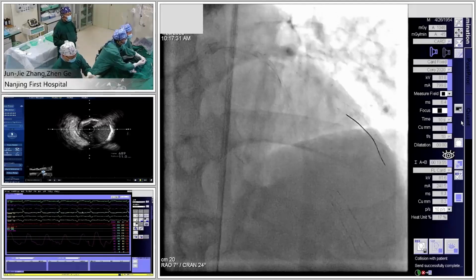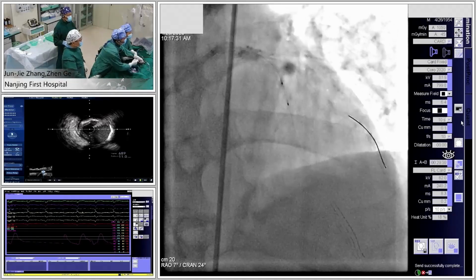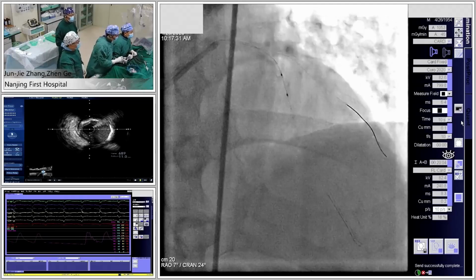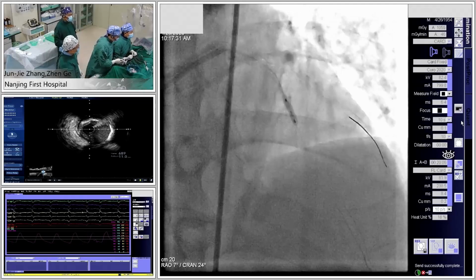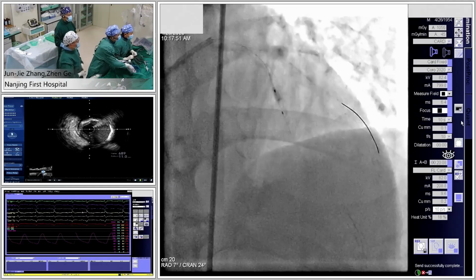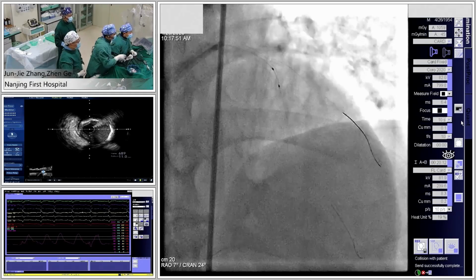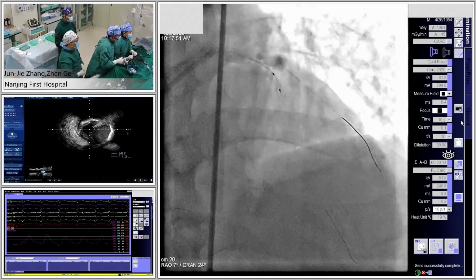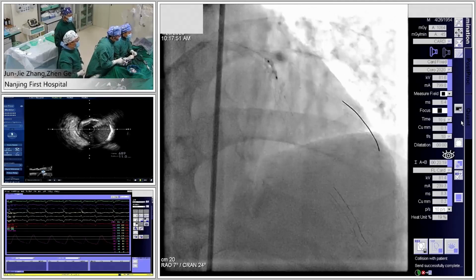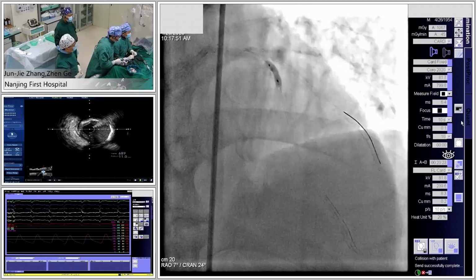Here is the small middle. You can see it is a critical lesion, 12, of the mid LAD. Be careful. Just gradually. Here, that's the right position. Too proximal. I think you should advance a little. Gradually, 6, 8, 10.